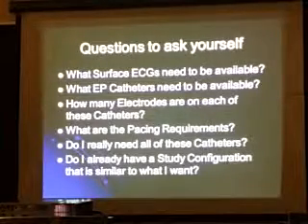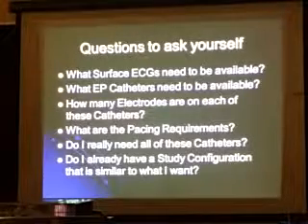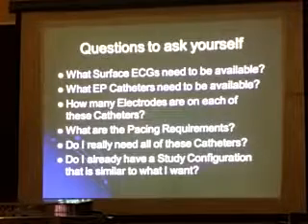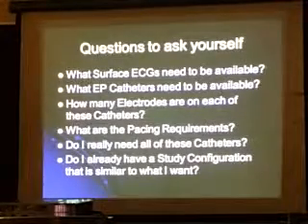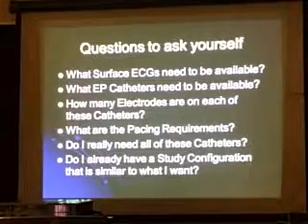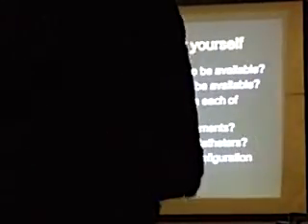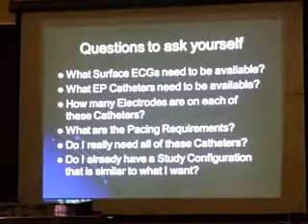So we've had systems that literally would take 2 minutes to fire up because they had 50 study configurations, because each physician had 10. Less is more. Yes, less is very much more. And then when the systems were crashing because of all this and they couldn't get things done, they were asking what the problem was, and we pointed at it and laughed and said, let's fix this for you. All right?